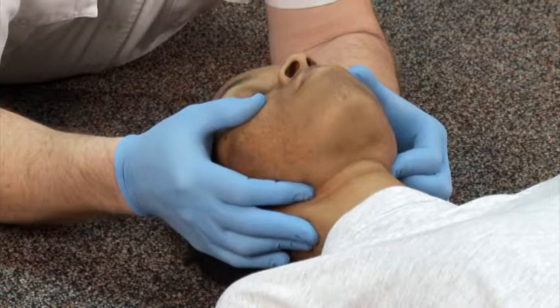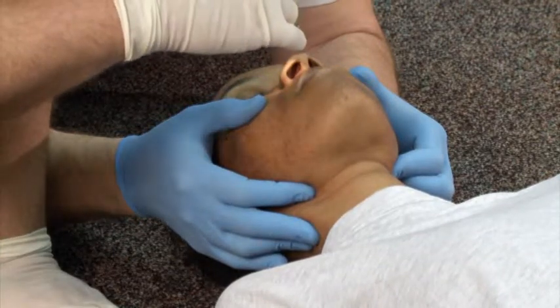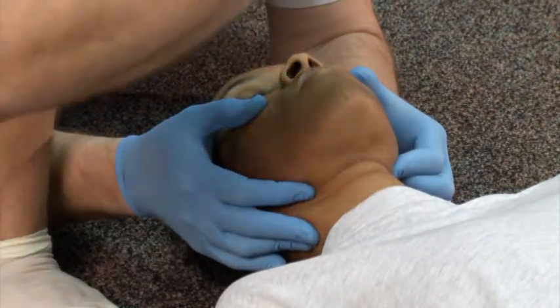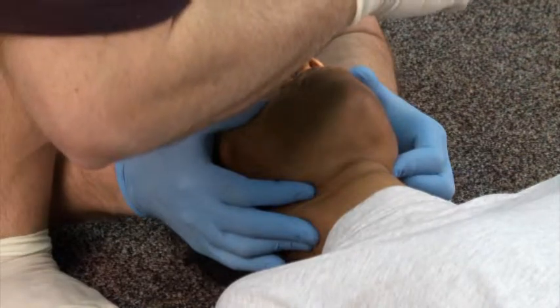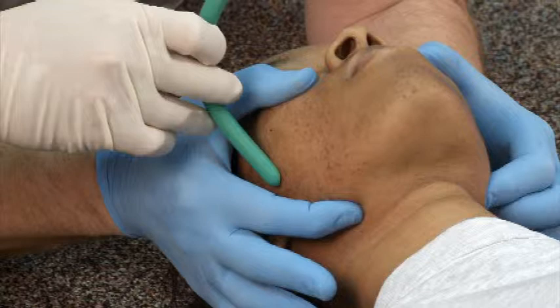The second provider examines the patient's nostrils with a light and selects the largest and least deviated or obstructed nostril, usually the right one. The second provider selects the appropriately sized NPA for the patient's nostril, a size slightly smaller in diameter than the size of the nostril opening, frequently the diameter of the patient's little finger.